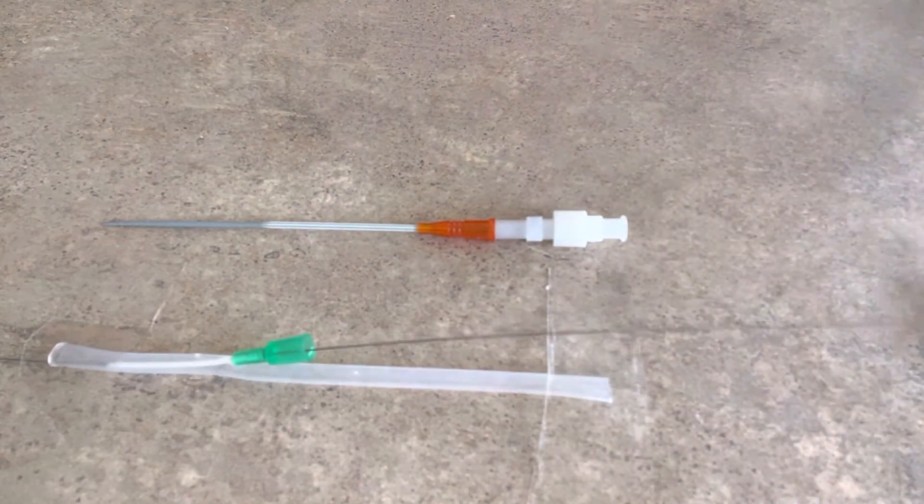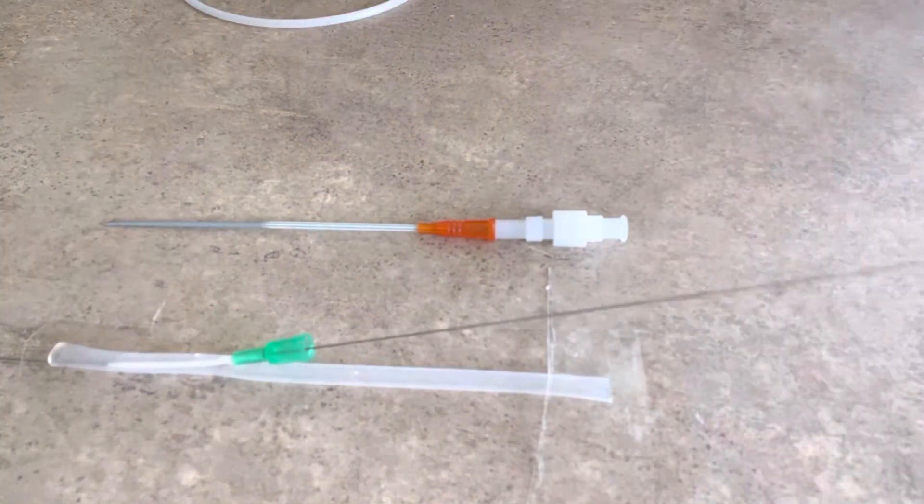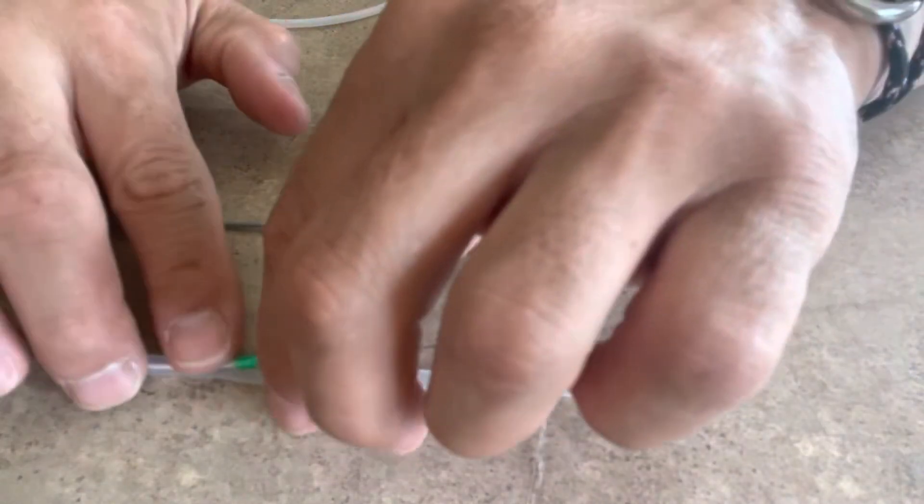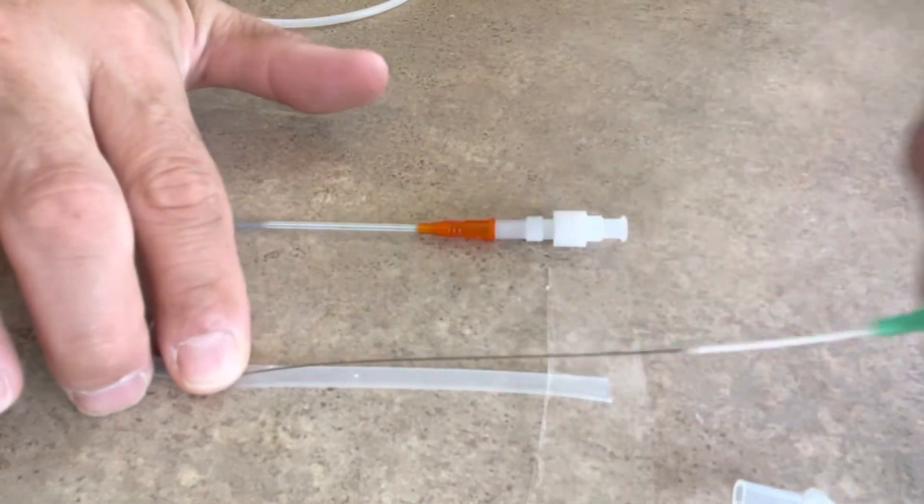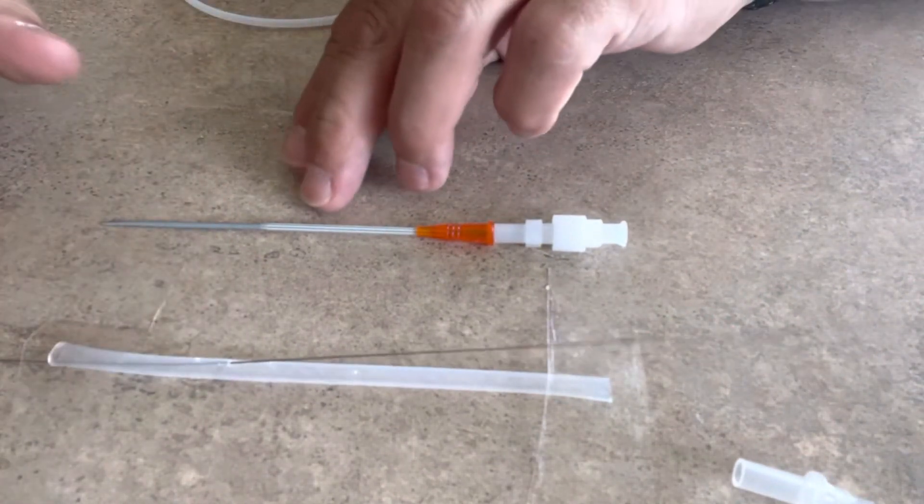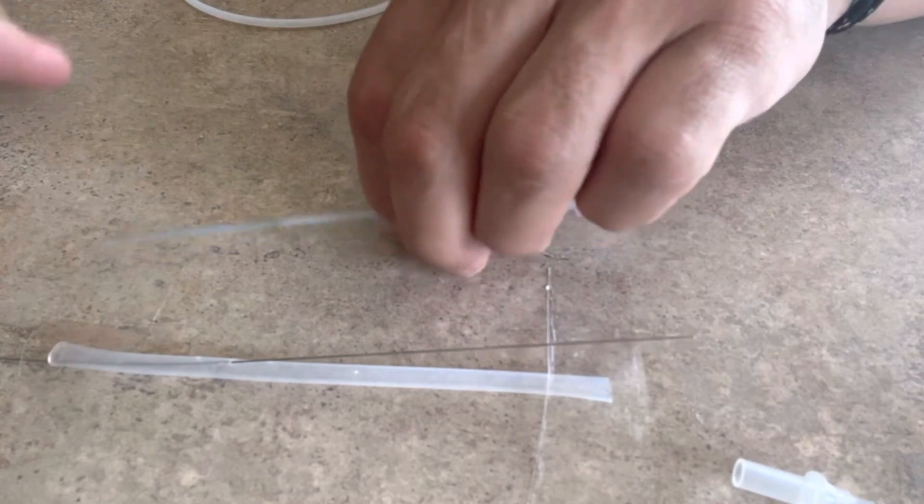Make sure you've got a decent amount of length in there, and then we're going to go from there. And just like any Seldinger technique, what you basically do is you take the angiocatheter off. And what I'm going to do, I'm going to pull this wire up a little bit and just show you.